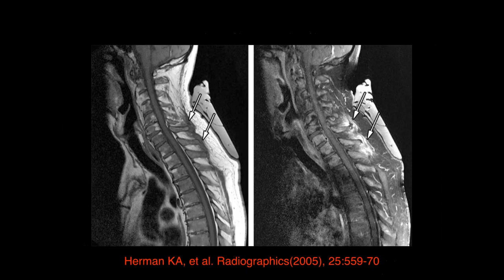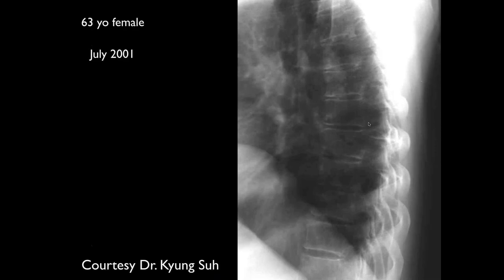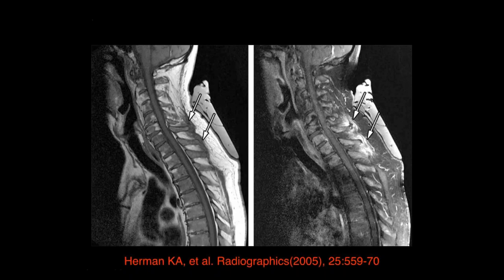Another case with edema in the posterior elements — again in the same category of diseases. This is enthesitis in a patient with systemic inflammatory disease. The T1 changes in the vertebral bodies are strange — you should see more fat. What's happening here is this is hematopoietic marrow, and these are areas where inflammatory disease has healed, leaving fatty marrow replacement.